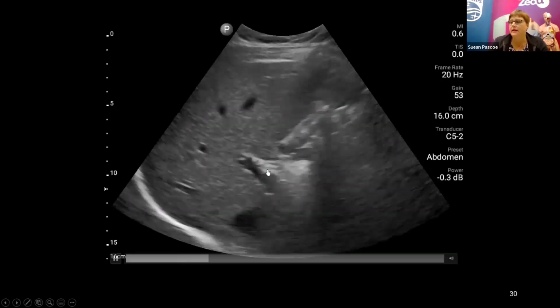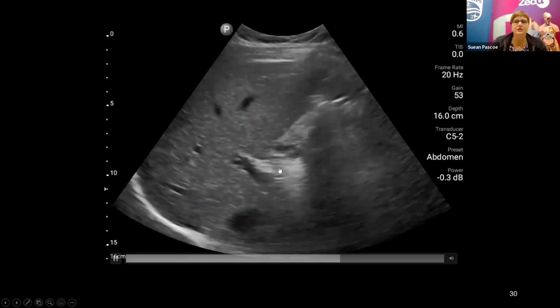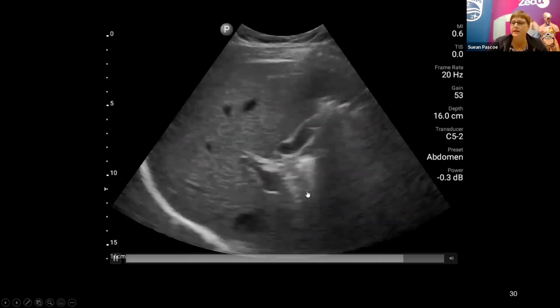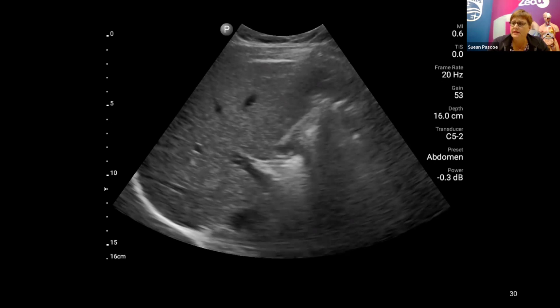So we can see it a little bit in parts here. I tried intercostal, and that's about as good as it gets on Mike. He's not a big guy, so it was a little disappointing, I must say, that I had so much trouble finding his bile duct, but that's the way the cookie crumbles sometimes.